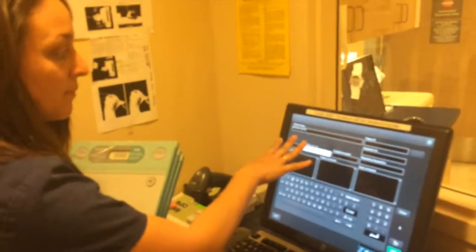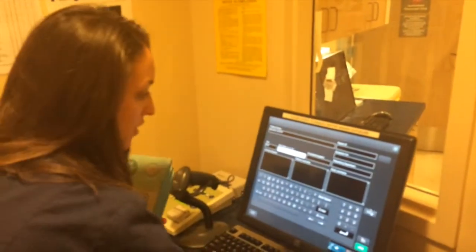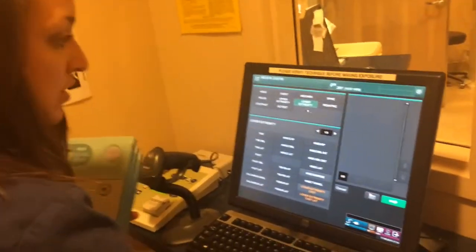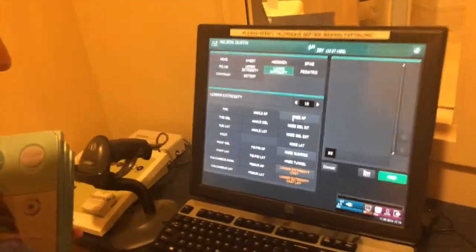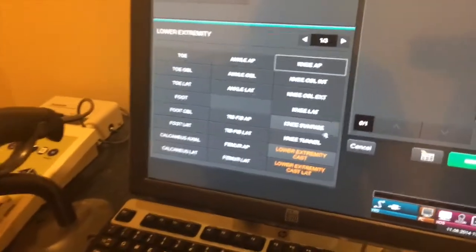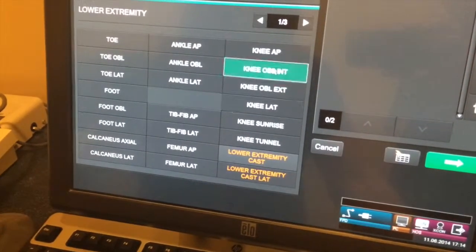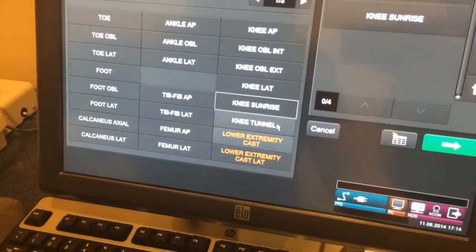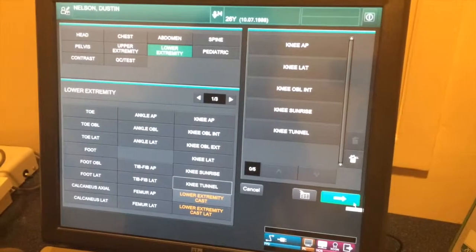So now I put Dustin into the computer. I ordered his name up, and I put in the session number and all his information. The images we did were lower extremity, a knee. We did the AP, the lateral, the internal oblique, and the sunrise and the tunnel. All right, now I'm going to scan my images.